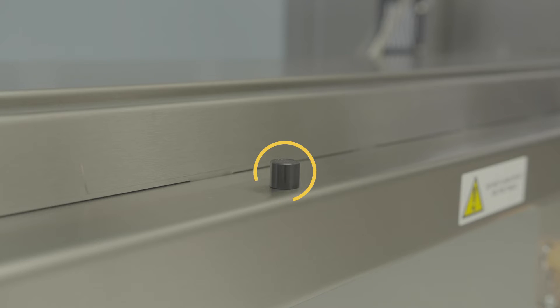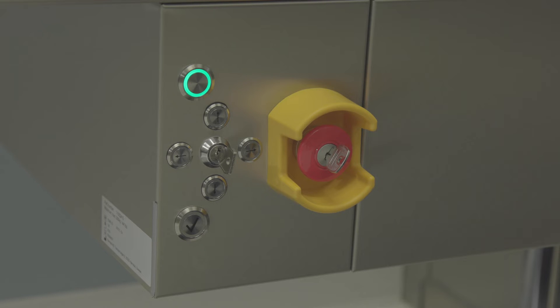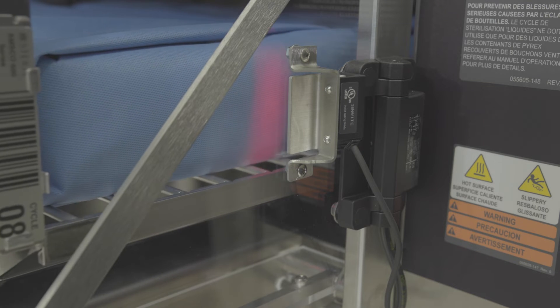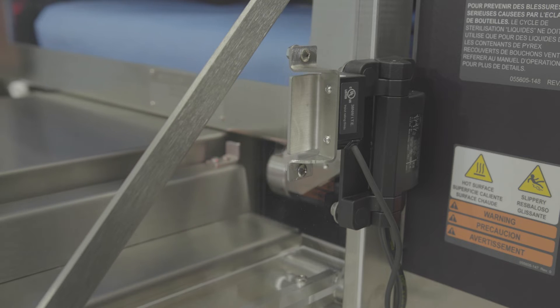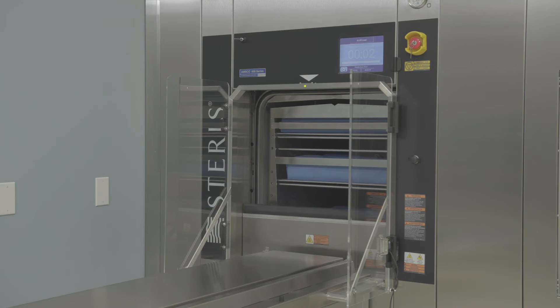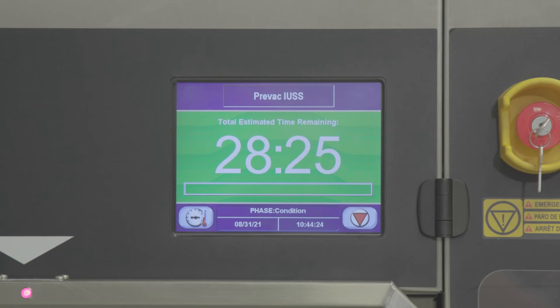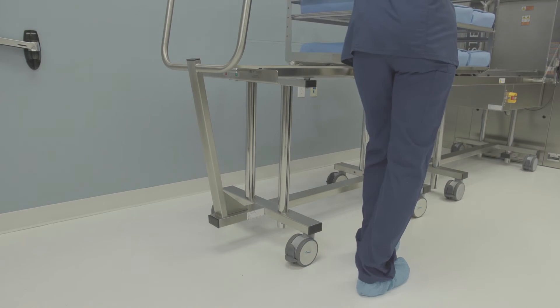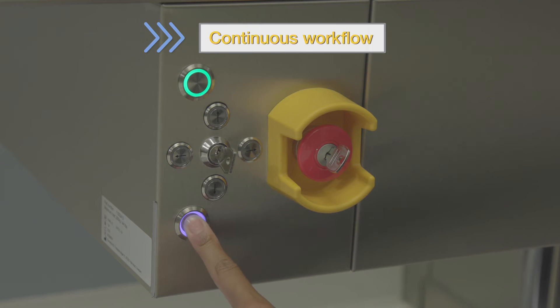The A-LIS table has a proximity sensor that confirms the loading car is in position. To automatically load the loading car, press the confirm load button on the A-LIS table — the ring around the button turns blue when activated. The barcode reader scans the barcode as the loading car moves through the chamber opening, telling the sterilizer which cycle to run. When the loading car is secure inside the chamber, the door closes automatically, the cycle begins, and the countdown is displayed. For double door sterilizers, the next load can be set up while the other load is being sterilized, creating a continuous workflow.